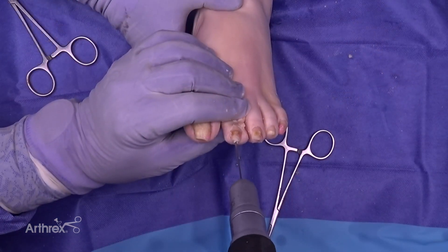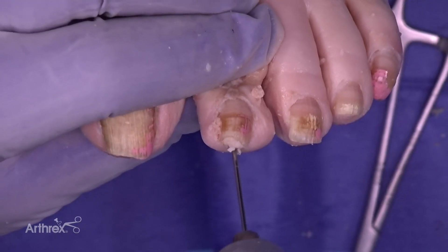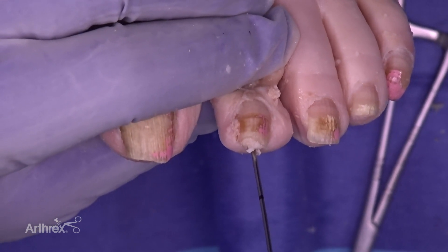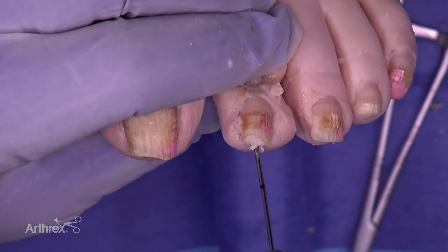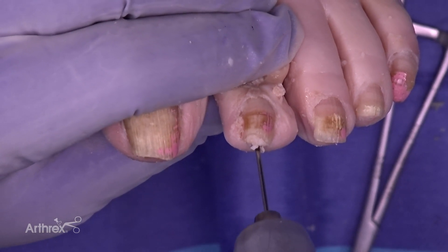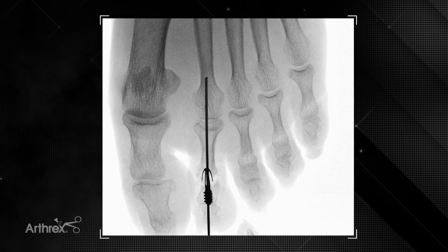At this point we are going to advance the wire to expand the barbs in the proximal end of the implant across the second metatarsal phalangeal joint. You want to insert this until the laser line is at the tip of the digit. Because the distal end of the wire is malleable, it can be bent in a standard fashion.